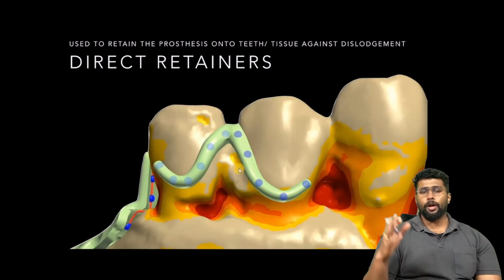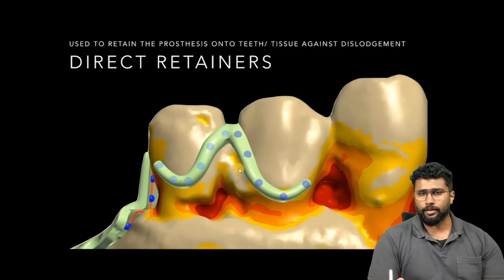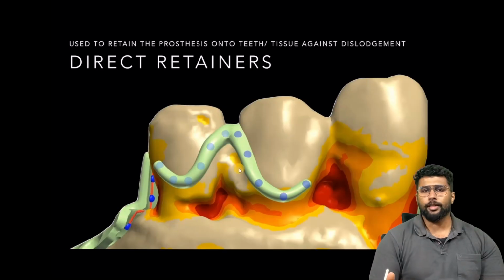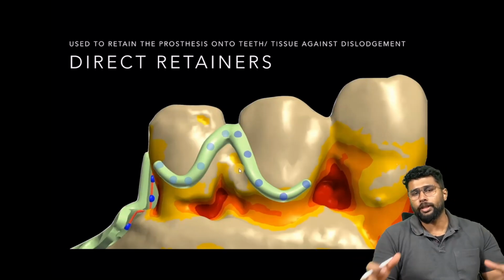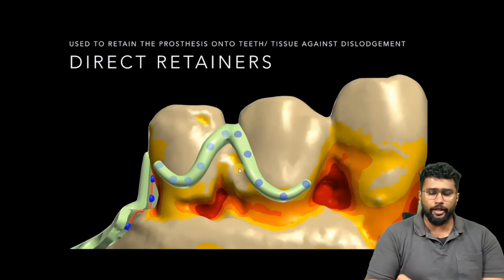Okay, now with that said and done, we are going to go ahead with direct retainers. These are the components that are going to be holding on to the teeth and preventing your denture base from lifting away from your underlying tissues.